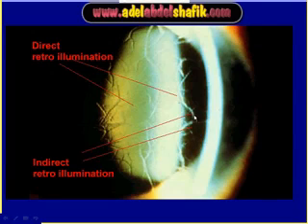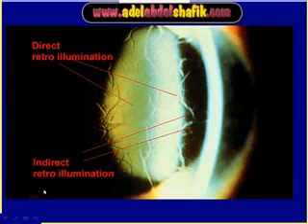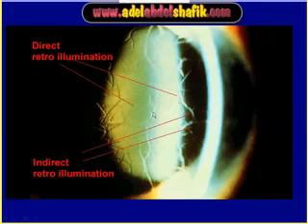You can also notice that we can see some lines against darkness — this is indirect retro illumination. So if you examine against the light it is direct retro illumination; if you examine the lesion against black, this is indirect retro illumination.